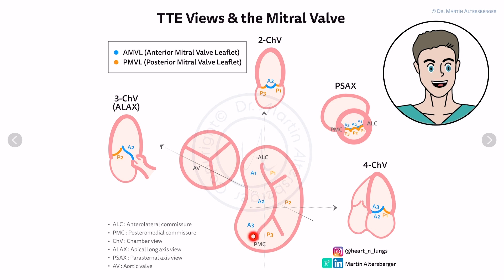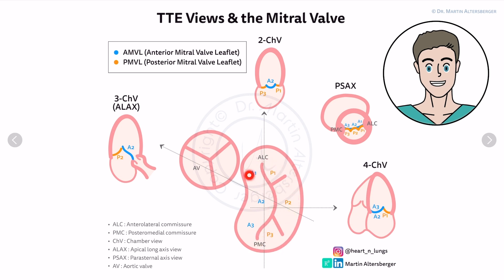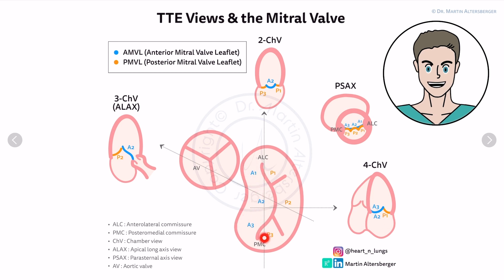The mitral valve is very complicated. It has an anterior and a posterior leaflet, and these are divided into three parts each: A1 (anterior leaflet part one), A2, A3, and the posterior leaflet segments P3, P2, and P1.